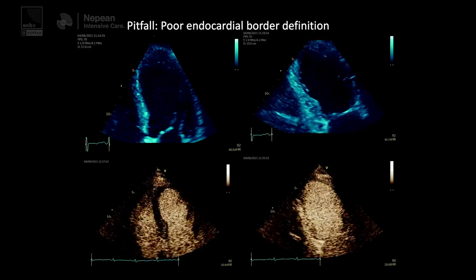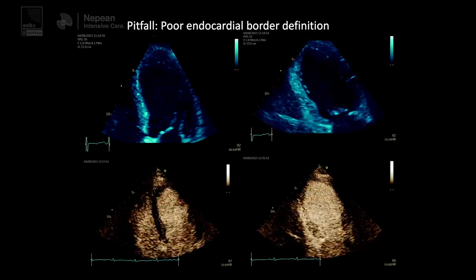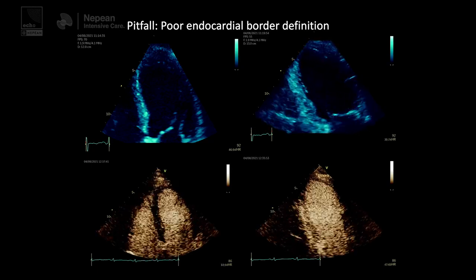This could be left anterior descending coronary pathology, but the other big differential is Takotsubo — which is what this patient ended up having. They had a septic cardiomyopathy with a Takotsubo-type pattern. Contrast also gave the ability to look for any apical thrombus, and that apex is doing nothing — which is another reason we gave it. Because as you were saying, you can't see the apex very well, and whenever you see a hypokinetic or akinetic apex, that's absolutely what you should be looking for.